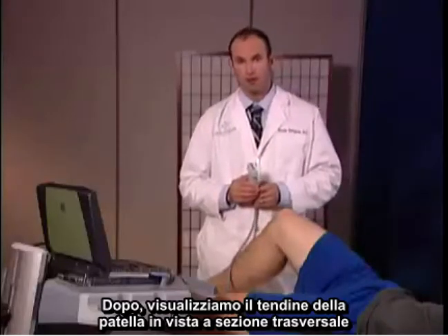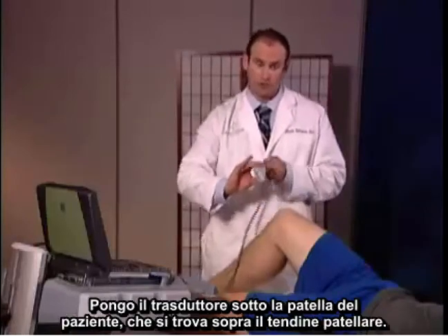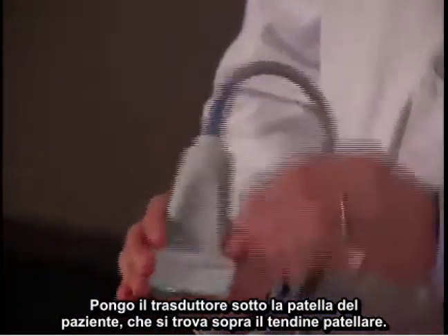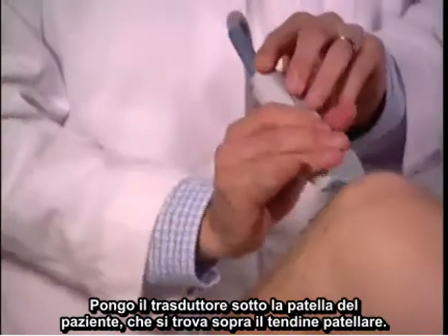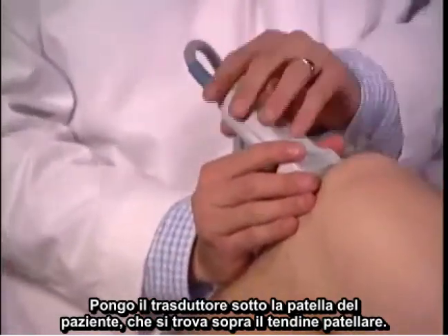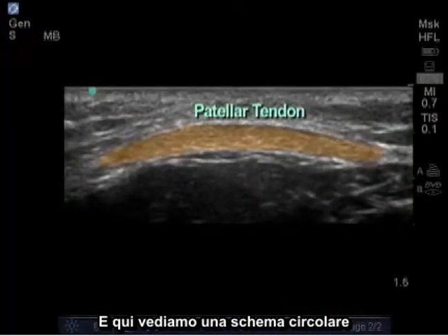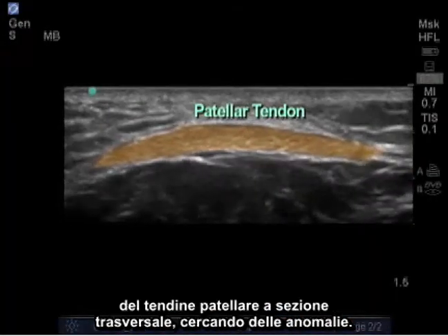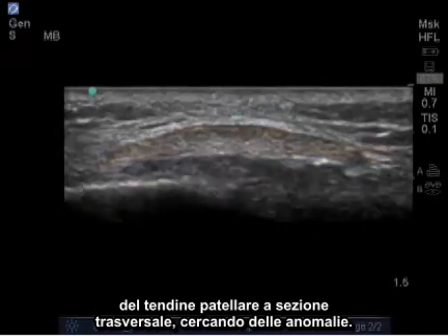Next, we're going to view the patella tendon in cross-sectional view. I'm going to place the transducer beneath the patient's patella, just overlying the patella tendon. Here we're going to see a circular pattern of the patella tendon in cross-section, looking for any abnormalities.